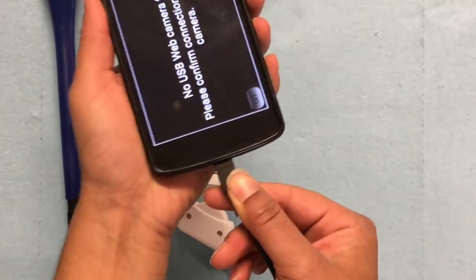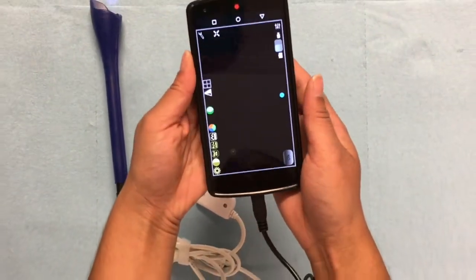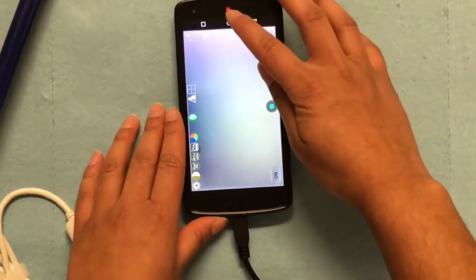Next, I will show you how to operate the app on your phone. If the app automatically opens, as it just did, you can go on to the next step. If not, click the USB webcam pro icon on the phone home screen.